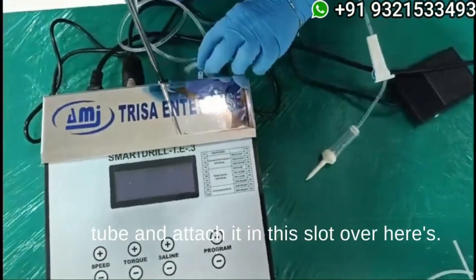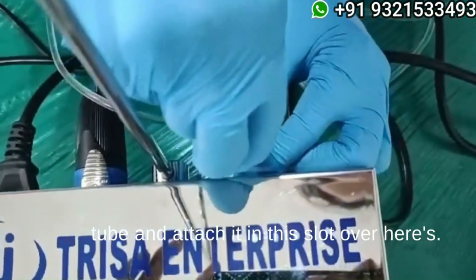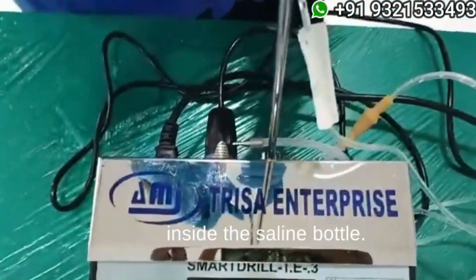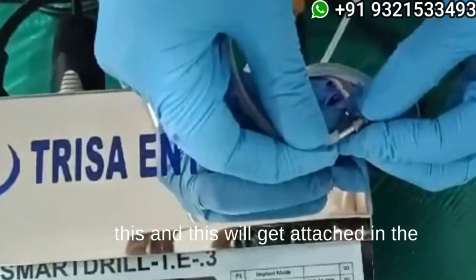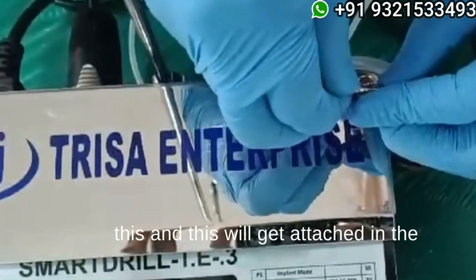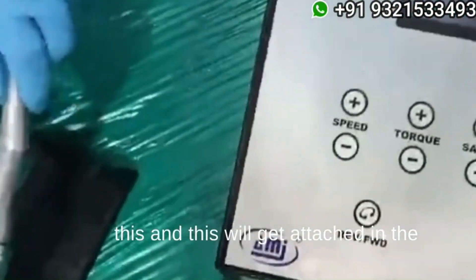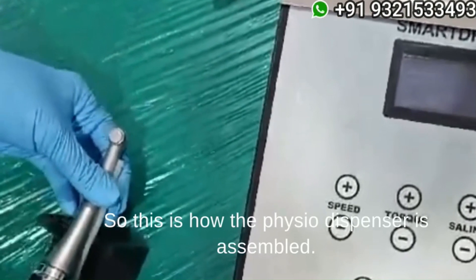The second attachment goes inside the saline bottle — this thin tube will go inside the bottle, and this will get attached to the handpiece so that the irrigation can happen.